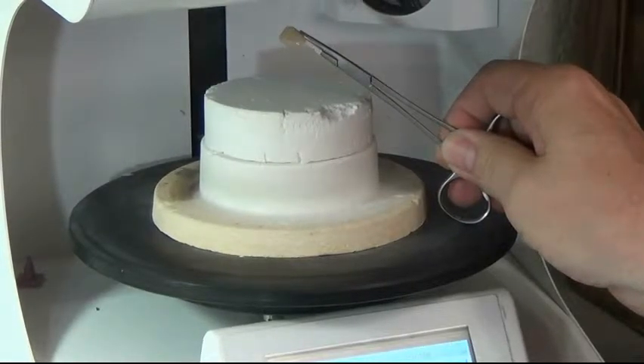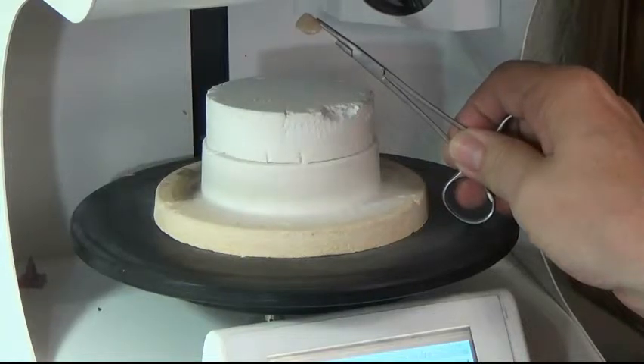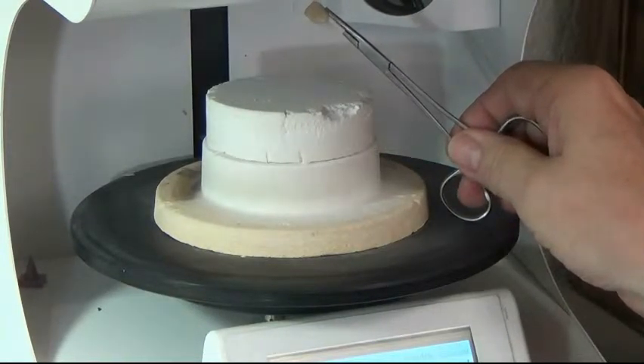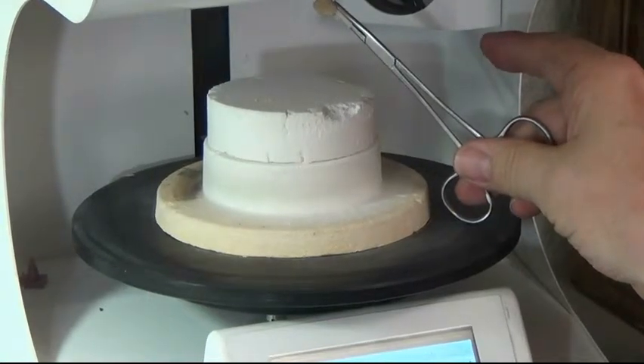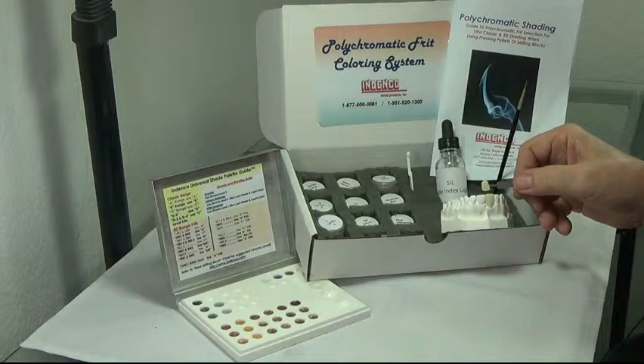Before we go with the final glazing procedure, one of the real nice options is the Fluorescent Spray Glaze from Indenco. Before we use it, we want to hold our crown underneath the muffle to let it evaporate and lose the surface gloss, then we'll put on the Fluorescent Spray Glaze and fire it all in one firing. This is a shade that we just finished with a separate enamel crack line using the Indenco Polychromatic Frit Shading System — a unique system offering Refraction Illumination versus Opacious Reflection Masking from common staining. Thank you for your time and looking forward to working with you.